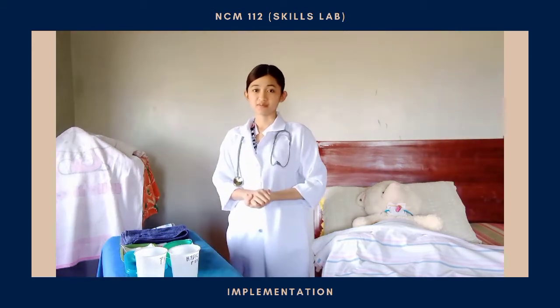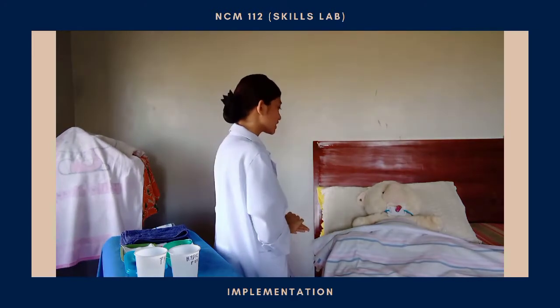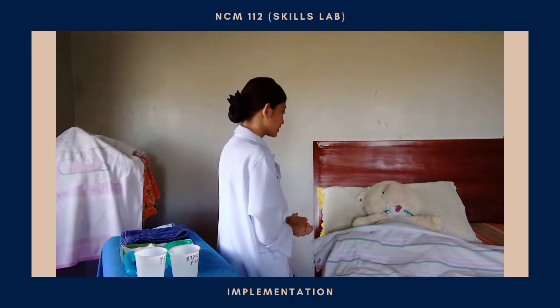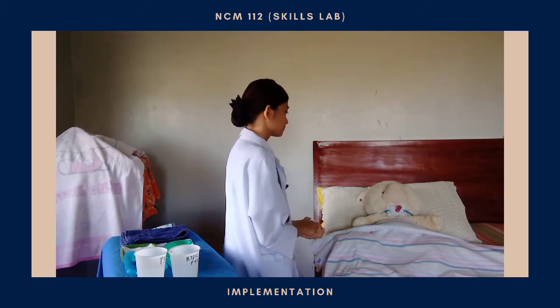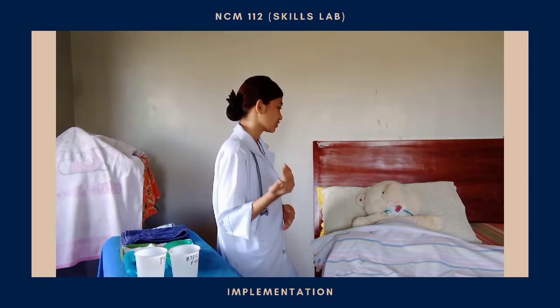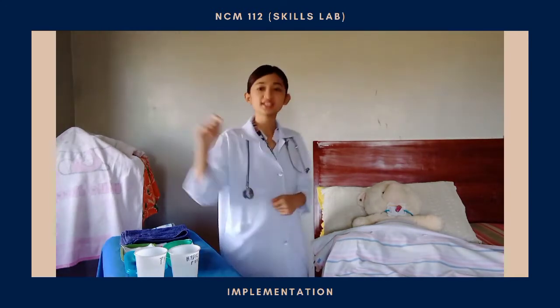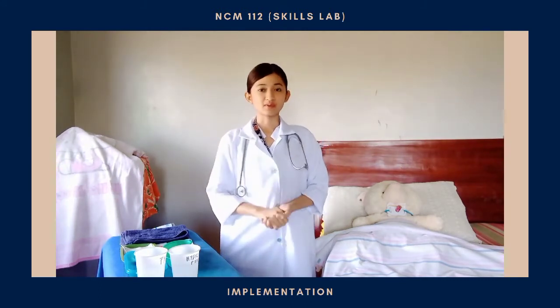Then, identify the patient. Good morning, ma'am. I'm Hanz Nicole from the NUSC, and I will be your student nurse for today. May I know your name, ma'am? And your date of birth? Okay, that's great. So, would you like me to close your curtains and your door to the room? Okay, then close the curtains and close the door to the room if possible.